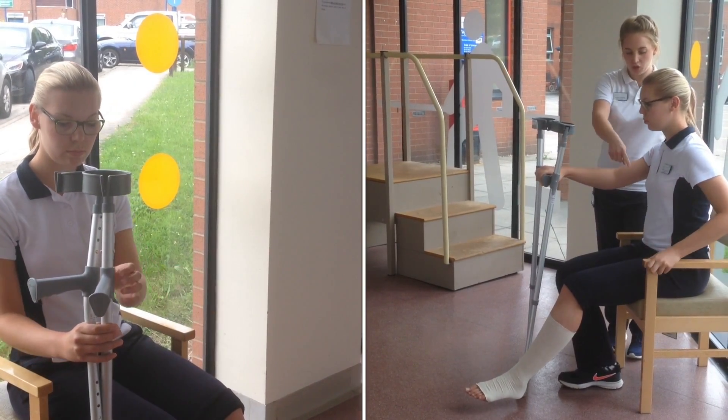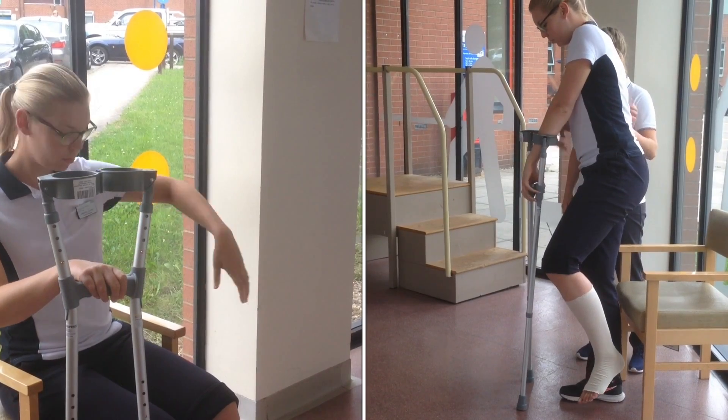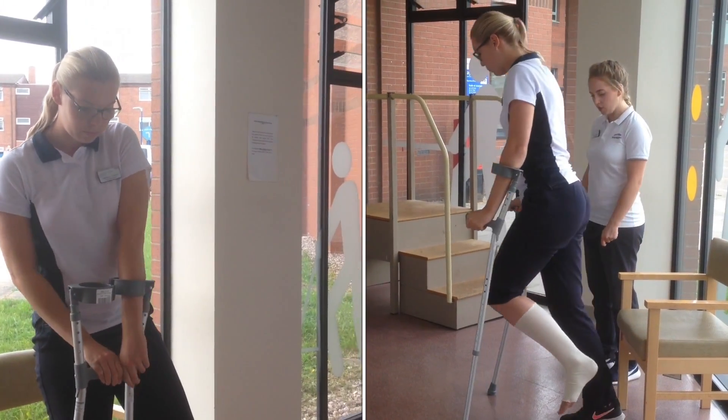Hold the crutches with one hand, pushing up with the other hand on the edge of the chair. Stand up on your good leg. Put one arm each in the crutches. Now use the crutches to go out in front of you and hop into them.